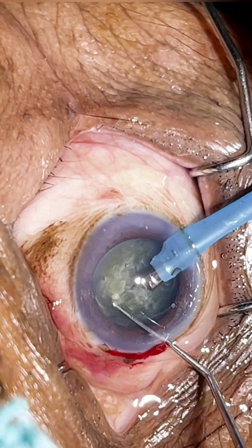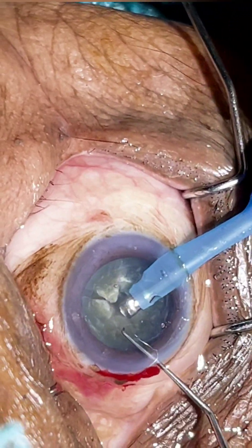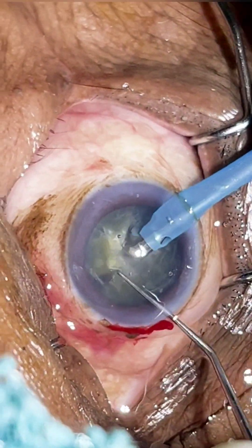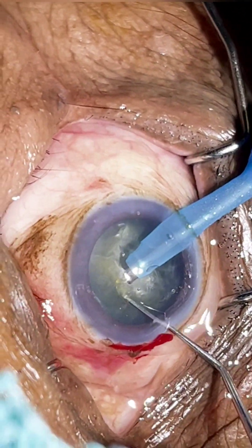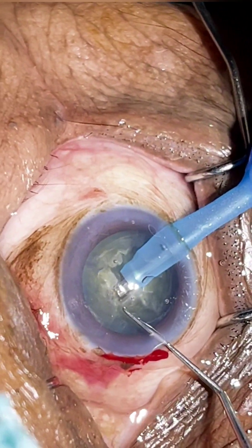This is the secret: whenever there is a thick and elastic endonucleus, it doesn't get divided easily. What we have to do is make a small groove before doing the first chopping. When the groove is made, the phaco tip goes smoothly into the matter of the nucleus, and hence we get the nucleus divided into two hemi-nuclei.